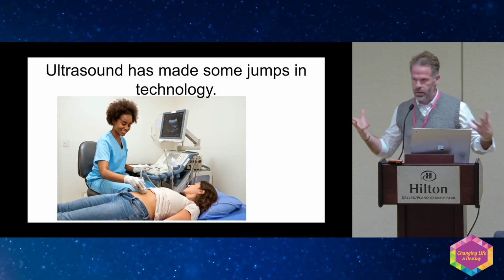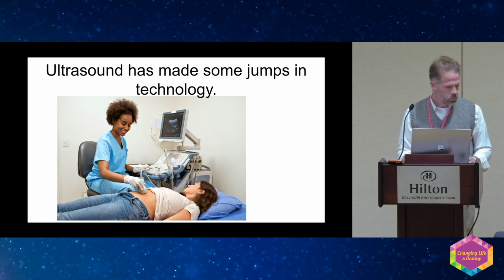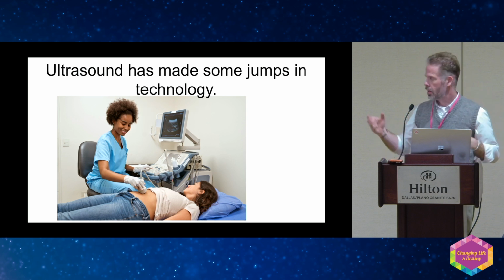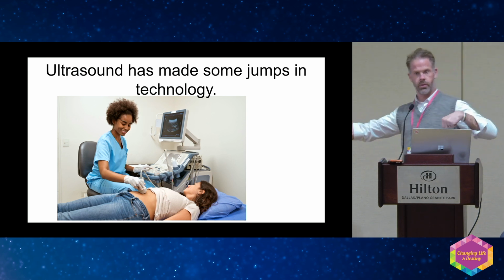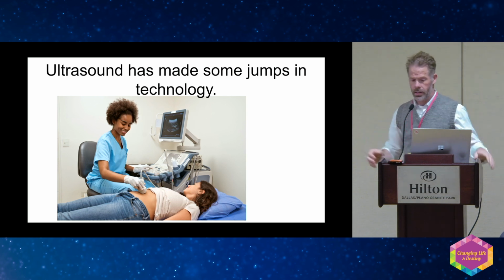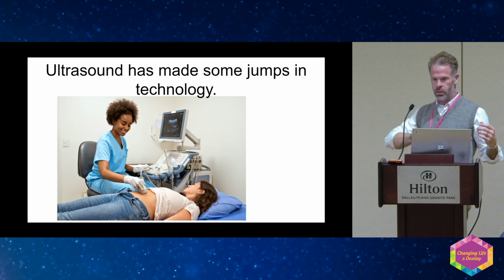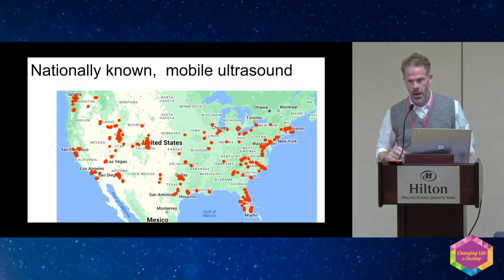So this is what you see. These ultrasound machines, they're useful, they're great, but the new ones plug into your cell phone. They're digital. They can see every part of the body. With the bigger ones, I need a different ultrasound probe for every part. For your heart, I need one probe. For the belly, I need another probe. It's a lot. But the digital probes, man, they can emulate. You can look at a pregnancy one minute, and the next patient, you can look at the AAA. It's just awesome stuff.